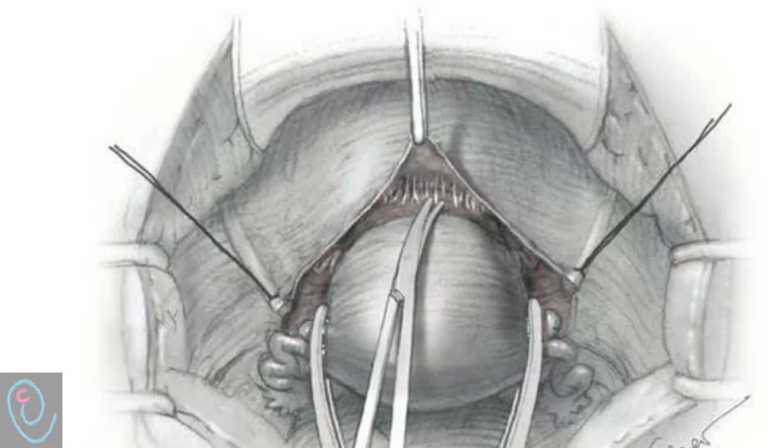Alternative methods include gentle, blunt pressure from fingers or a sponge stick. This pressure is directed caudal, beneath the bladder and against the cervix. Dissection in the midline minimizes laceration of vessels that course within the vesico-cervical ligaments, known as bladder pillars. Once the correct plane is entered, the pearly white cervix and the anterior vaginal wall are clearly differentiated from the reddish bladder fibers. The bladder is ideally dissected off the anterior vaginal wall at least 1 to 2 cm below the lower margin of the cervix.